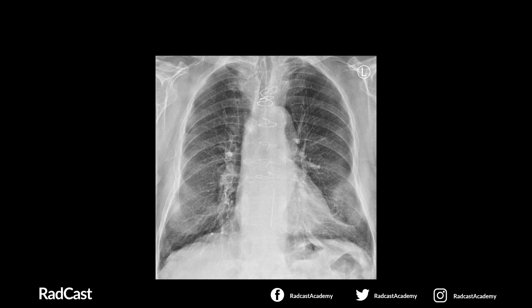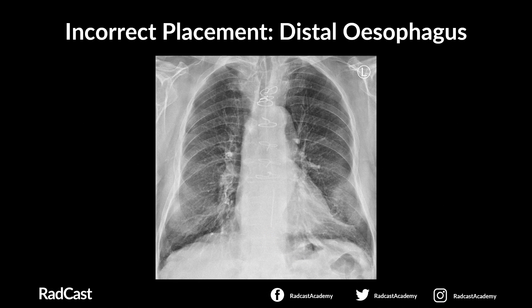With the next chest x-ray, after confirming patient details and viewing field: step one, is the NG descending in the midline following the path of the oesophagus? Yes. Step two, is it bisecting the carina? Yes. Step three, is it crossing the diaphragm in the midline? No — the NG tube is visible above the diaphragm, and the tip is sitting in the distal oesophagus. The tube has not been advanced far enough into the stomach and would need to be advanced further before it is safe to use.